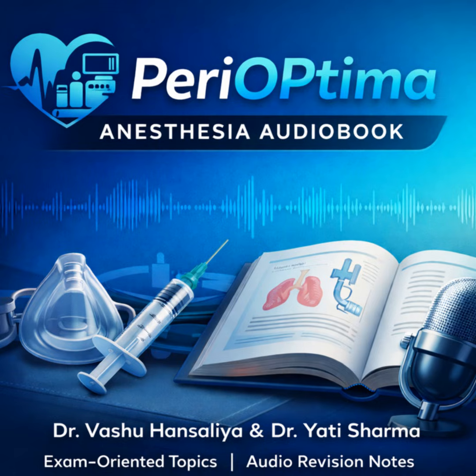What are the mandatory headings the examiners will be looking for? Use clear, numbered, bold headings that correspond directly to that 6-point classification. 1, gas supply safety. 2, oxygen-specific safety, and so on. And under each one? Use succinct subheadings, purpose, mechanism, and be specific, like PISS 25 for O2, 35 for N2O, and critically, add a subheading like exam caveat or limitation to highlight the major vulnerabilities we've discussed.